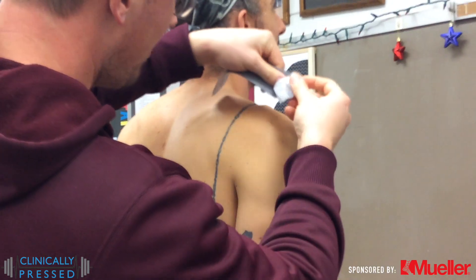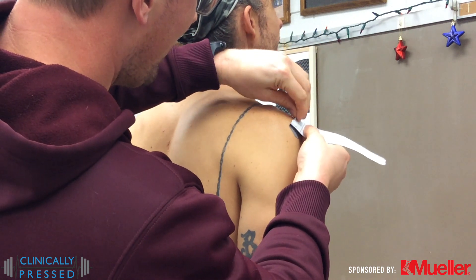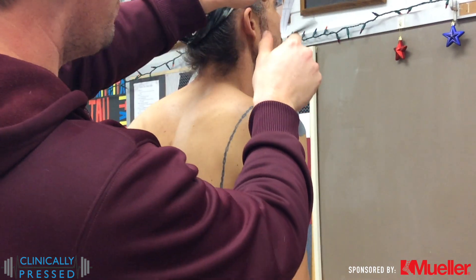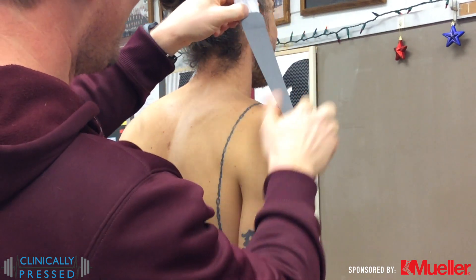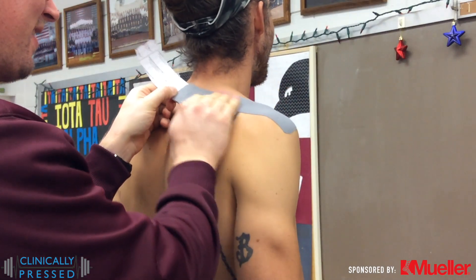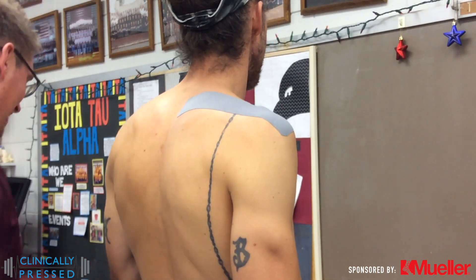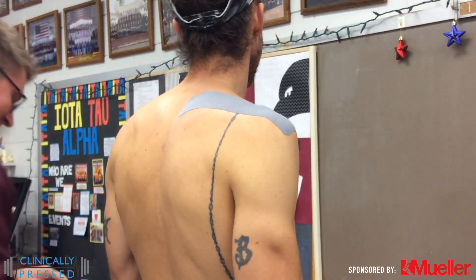We'll start with our anchor strip. For this one we're doing supraspinatus — we'll attach just over on the superior side of the shoulder going out to lateral deltoid and applying our tension, then working back up over and behind the acromion, then over the spine of the scapula, and laying down with that tension, then putting a nice and loose anchor strip.